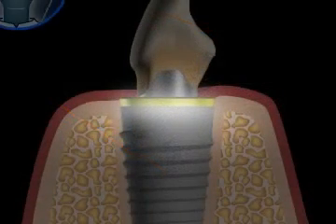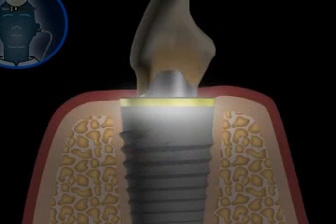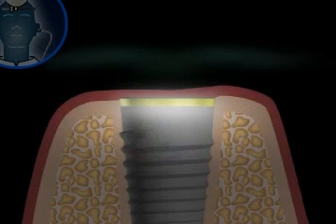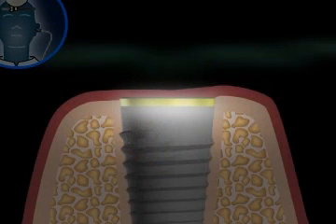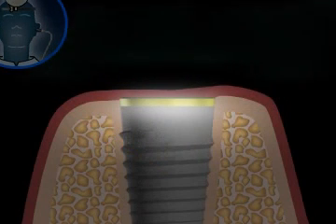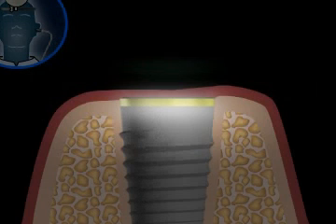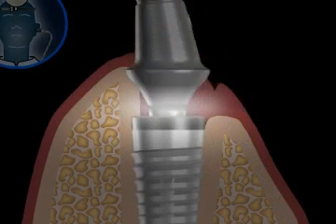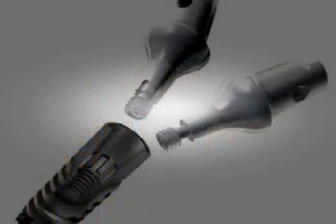Dentists observed yet another difference with conical connections that initially could not be explained. When the abutment is unscrewed from the implant for cleaning purposes, the dentist as well as the patient often experiences a very foul smell when a common implant system with traditional plug connections is used. This is not so with conical connections. Nowadays, this phenomenon has been explained. Again, the solution lies with the conical connection.